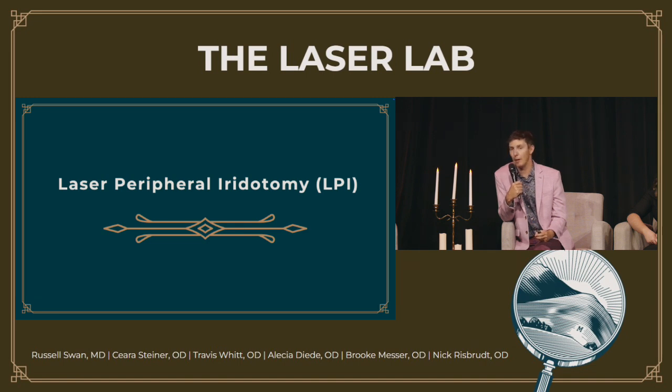And so that's one of the few times where I'll go up to 4 millijoules or higher, in a really fibrinous posterior capsule. Rarely you'll see this kind of fibrous response of the anterior capsule, what we call capsular phimosis, where the front part of the capsule will start to scar down.